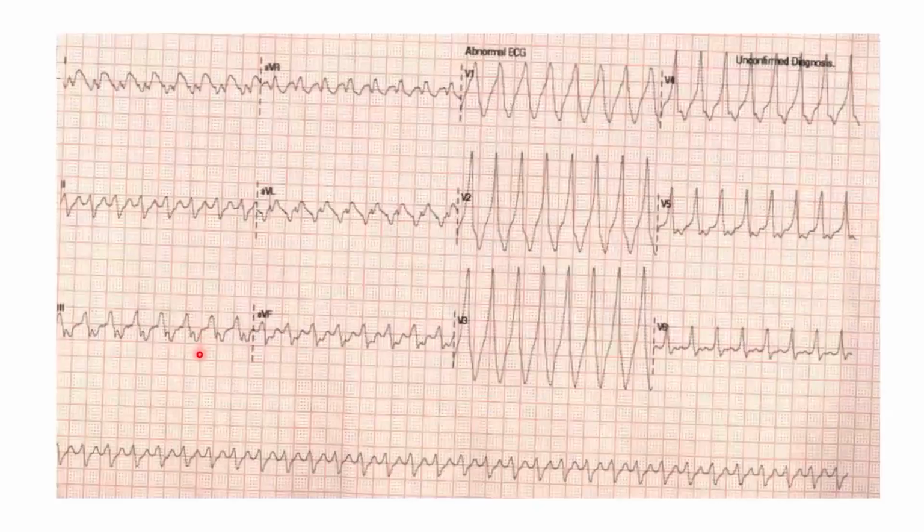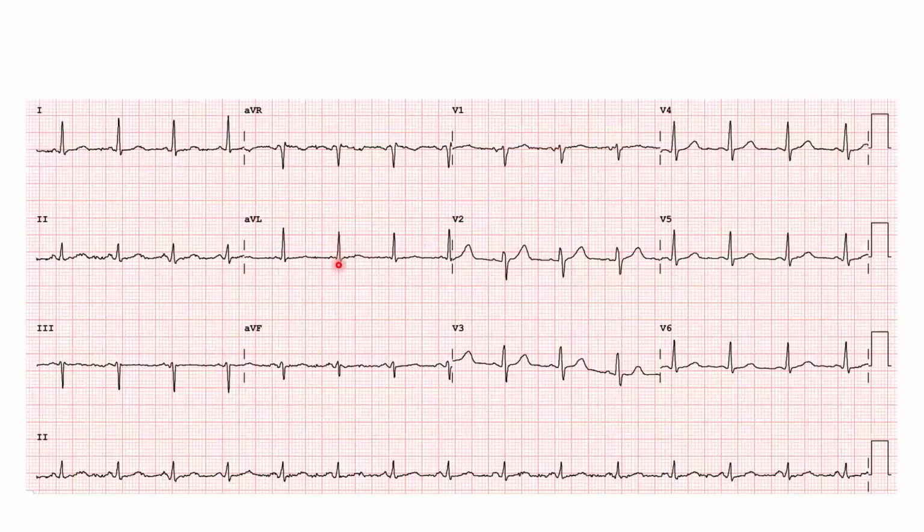This is an ECG of a patient who has a structurally normal heart. There's a wide QRS tachycardia, which is regular. It has an RBBB morphology, with a prominent R in V1. There's a negative QRS in 1 and aVL, suggesting a left-sided accessory pathway. This patient during sinus rhythm did not have any pre-excitation. It is due to the left-sided accessory pathway, which is far away from the sinus node. That's why during a normal sinus rhythm ECG, you can't see pre-excitation, because the AV node conduction is brisk and most of the QRS is activated by the AV node.